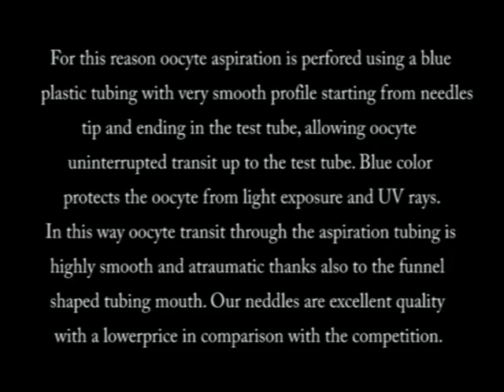For this reason, oocyte aspiration is performed using a blue plastic tubing with a very smooth profile, starting from the needle tip and ending in the test tube, allowing uninterrupted oocyte transit. The blue color protects the oocyte from light exposure and UV rays, making the transit through the aspiration tubing highly smooth and atraumatic, thanks also to the funnel-shaped tubing mouth.